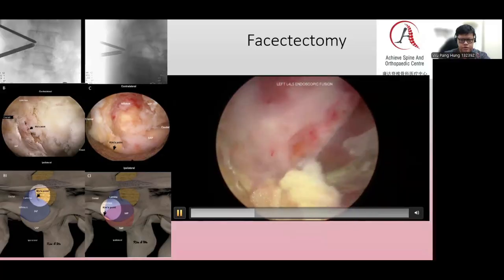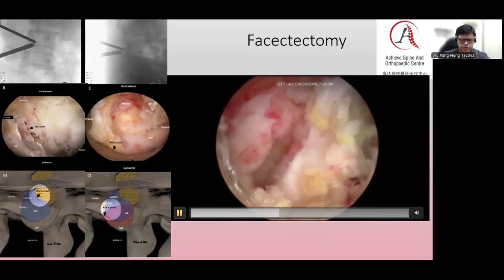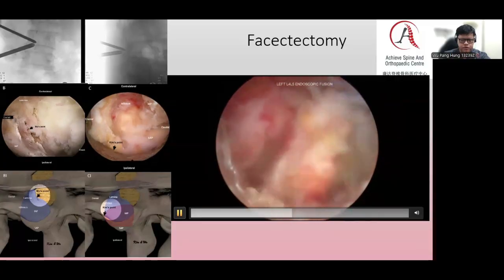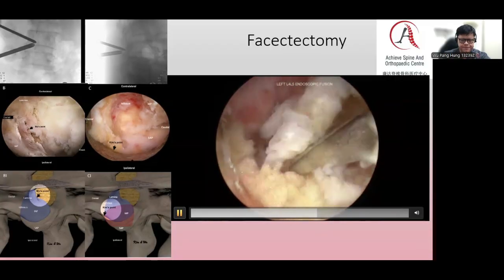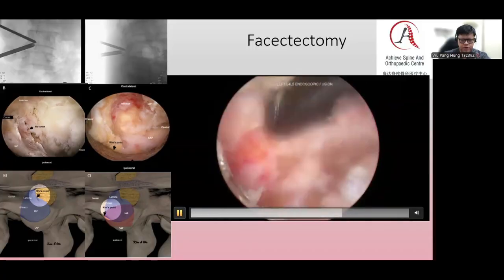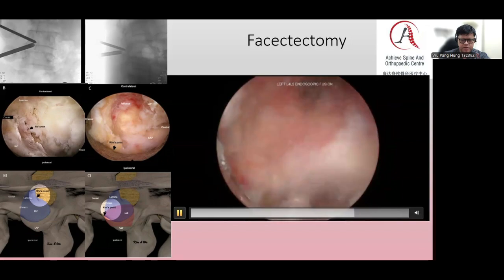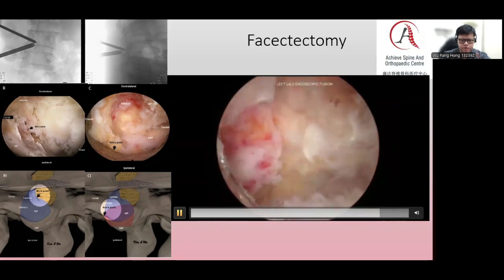Typically, we use a chisel to do that. If we do uniportal endoscopy, then we can use the drill to do this part of the surgery. The advantage of biportal fusion in this case is that we can harvest bigger pieces of bone. You can see that after we harvest that, we can see the interlaminar space, and large pieces of bone can be harvested and used as fusion material.